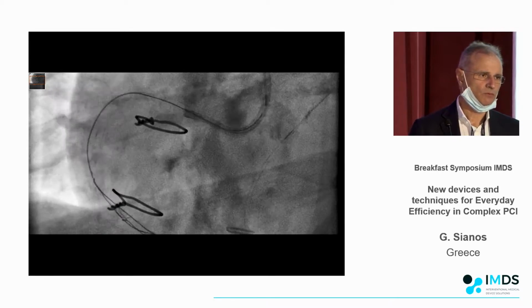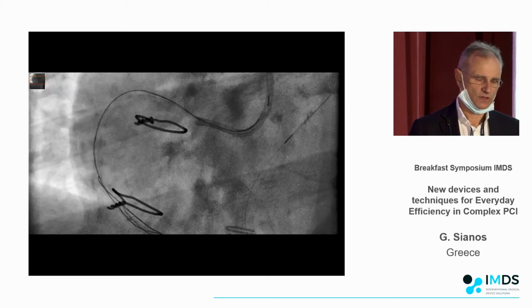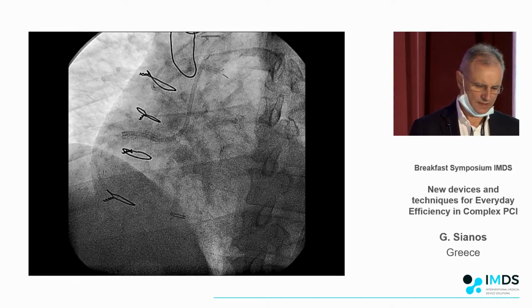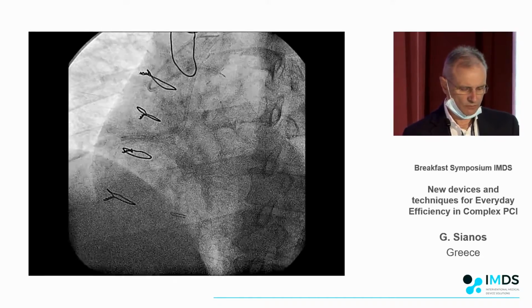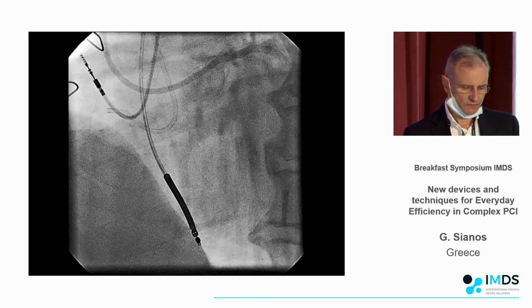So you don't have to push or overpush, let's put it that way. You just have to wait, keeping the right pressure in the device, and then slowly it goes down. That's how this case was concluded too, and it shows exactly that you have to be patient. You don't push it too hard, you push it up to the level that it has to be pushed, and then you wait for it.